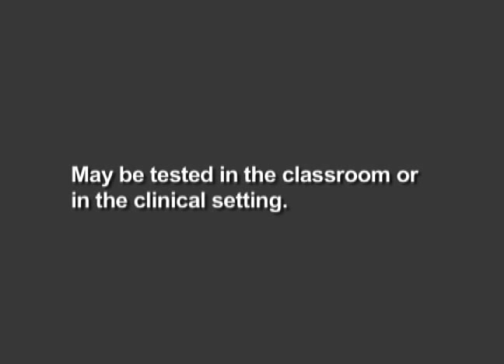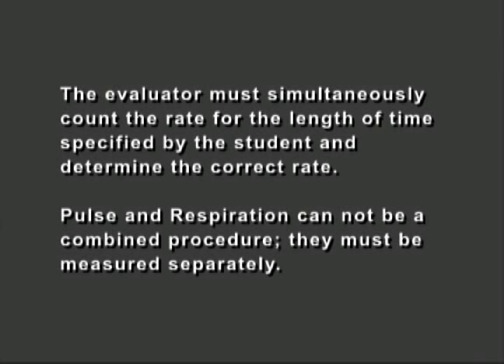May be tested in the classroom or in the clinical setting. The evaluator must simultaneously count the rate for the length of time specified by the student and determine the correct rate. Pulse and respiration cannot be a combined procedure. They must be measured separately.